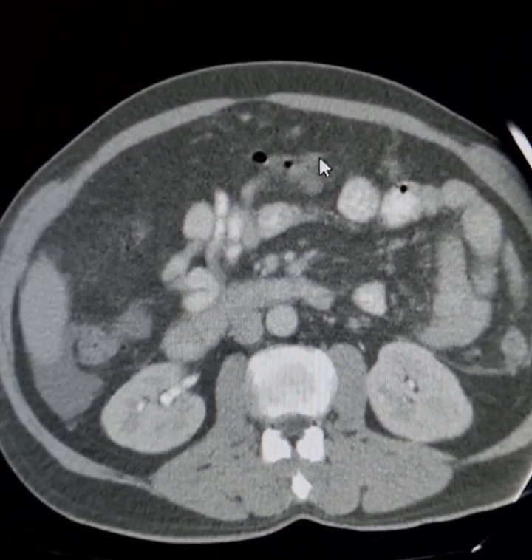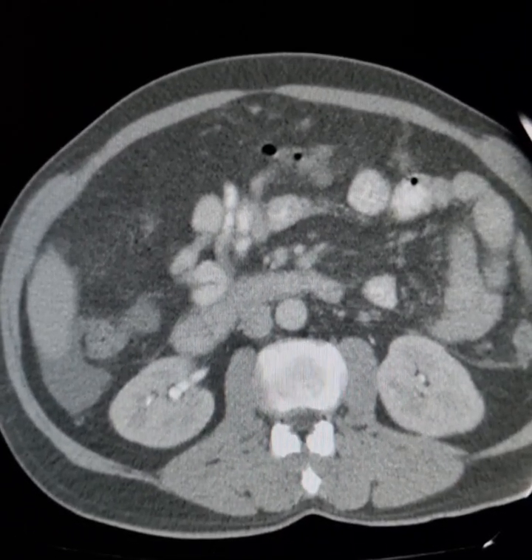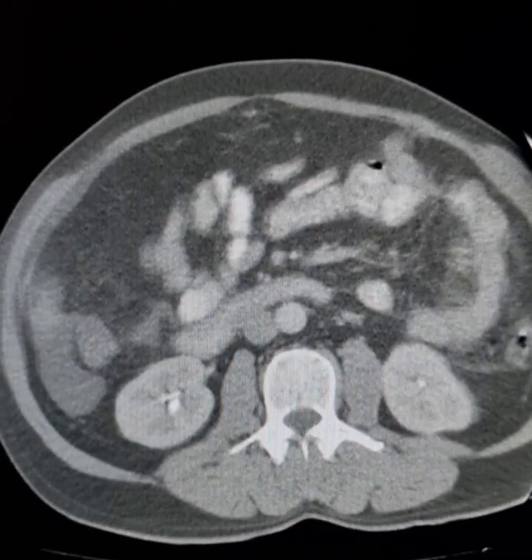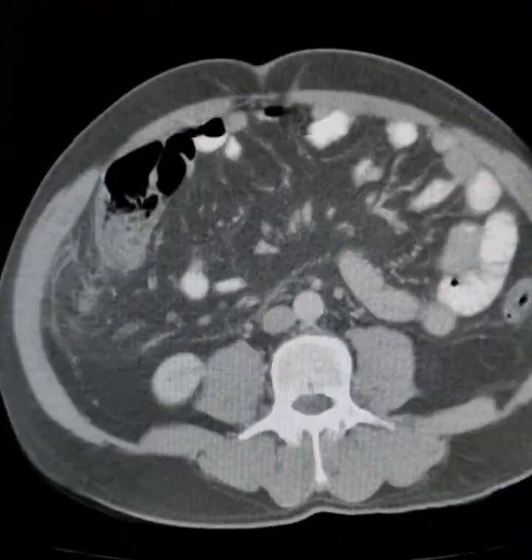This is the greater omentum. It is of normal density — no metastatic disease in the greater omentum.